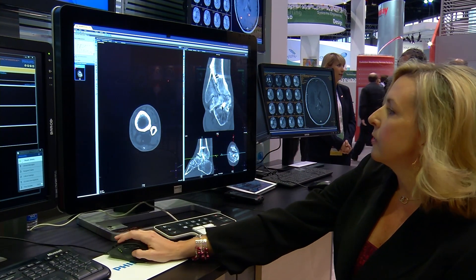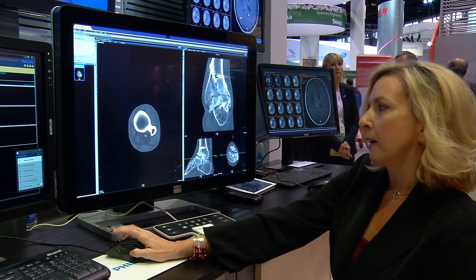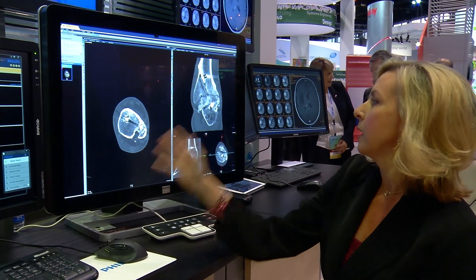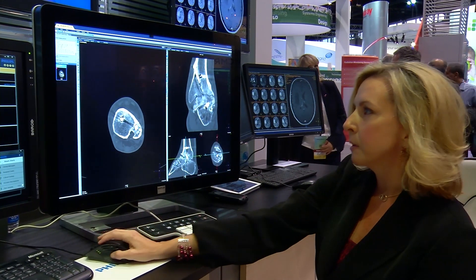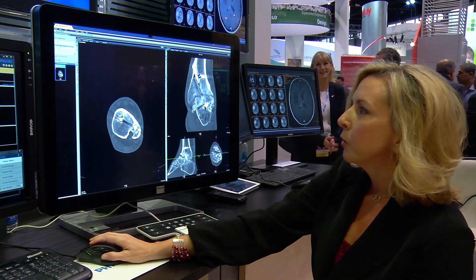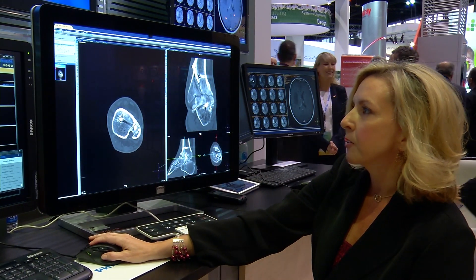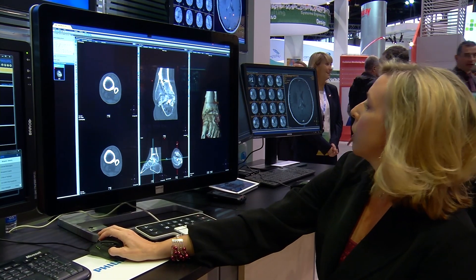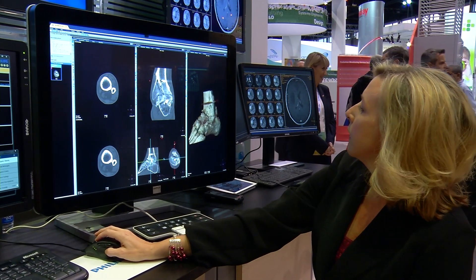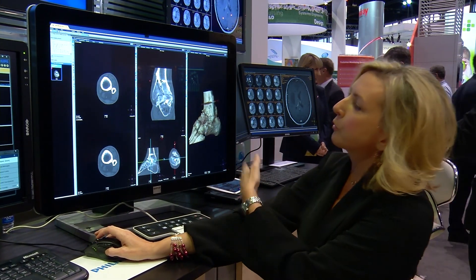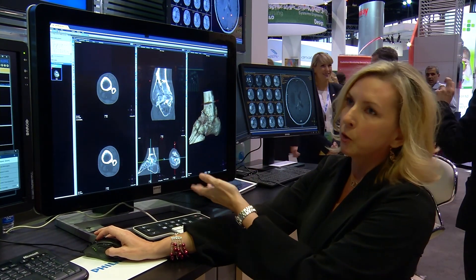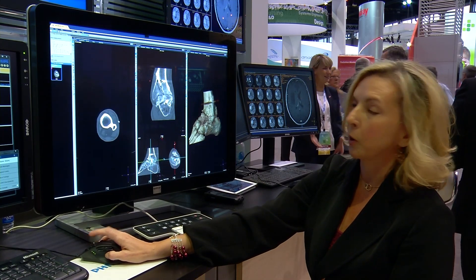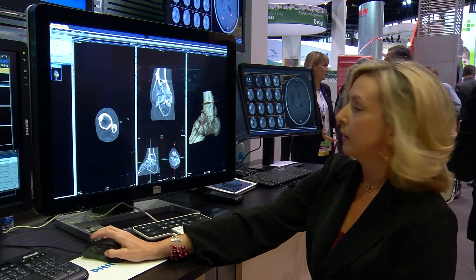In addition to still having your source images and reference images, you can also have customized hanging protocols that give you a 3D view, your MPRs, and your source images all in one spot.